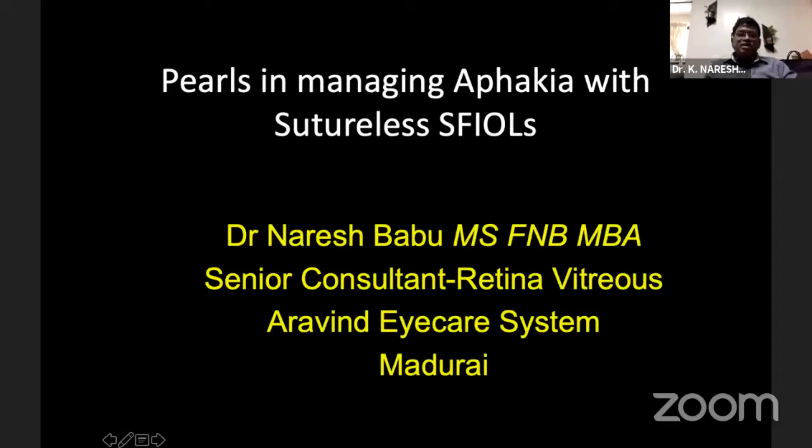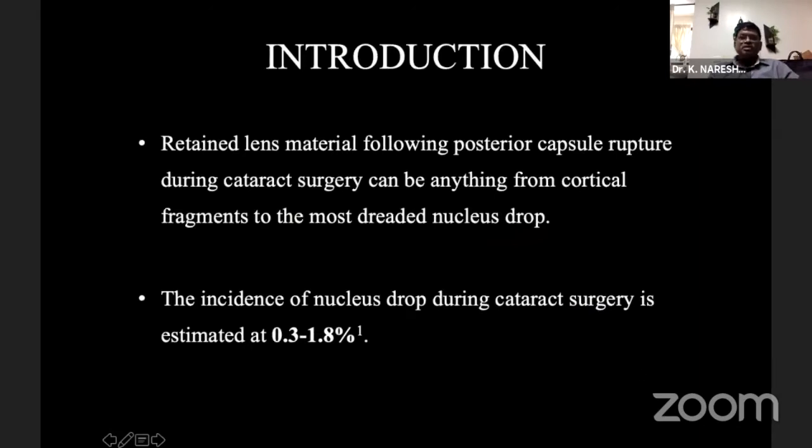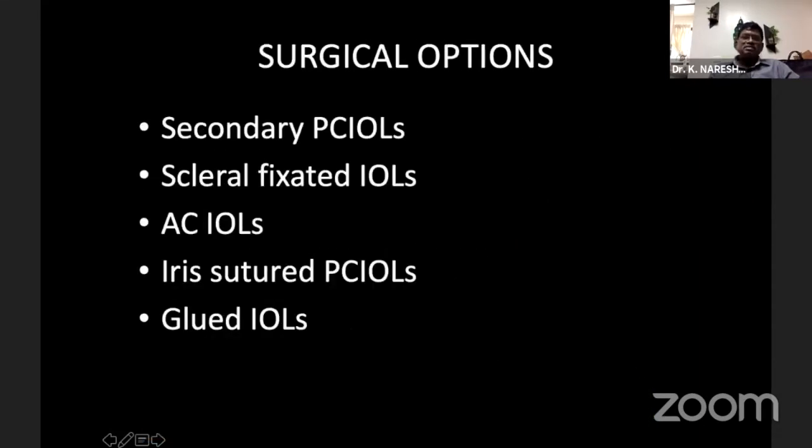Thank you, Dr. Avnindra. So this course, I think we have been doing for the last almost 8-9 years. Thanks to Dr. Avnindra for giving me an opportunity. Today, I'll be discussing how to manage aphakia with a sutureless intrascleral technique by Gabor's technique. I'll skip all these things because it has already been spoken about by Dr. Ritesh. We've got a lot of options like secondary PC IOLs or scleral fixated IOLs by various techniques, glued IOLs, iris sutures.